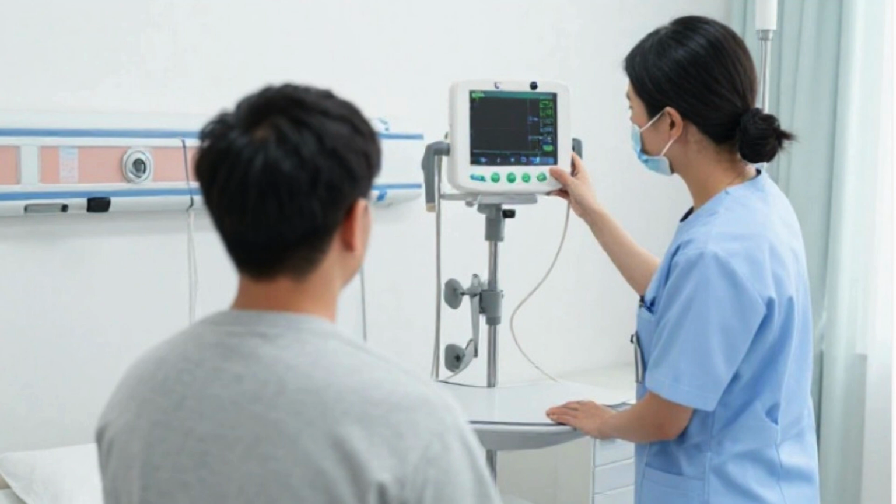Patient monitors are commonly used in areas such as intensive care units, emergency departments, operating rooms, and recovery wards. In these environments, patients often require close observation because their conditions may change rapidly. Unlike single-function devices, patient monitoring systems integrate multiple measurements into one centralized unit. Let us begin by discussing the basic components of a patient monitoring system.